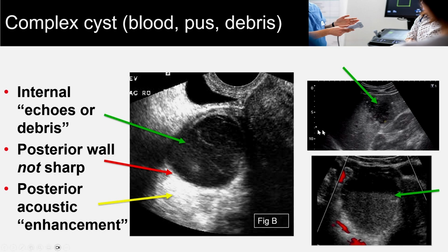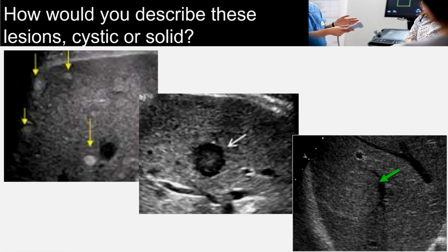And then you see a patient with a right ovarian hemorrhagic cyst where this was a simple dominant follicle cyst that hemorrhaged, and you can see a meniscus level from the layering hemorrhage. This shows that there's no color flow within that hemorrhagic cyst, and so we can exclude a complex cystic mass, for example. So again, 2 examples of more complex cystic lesions.